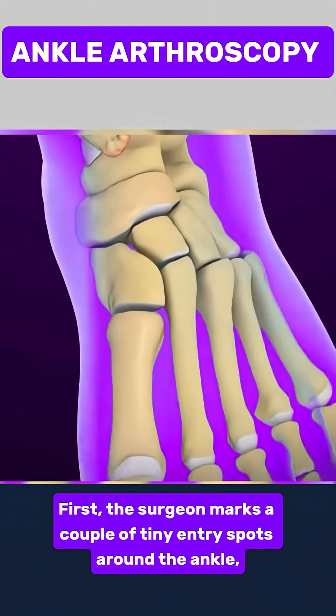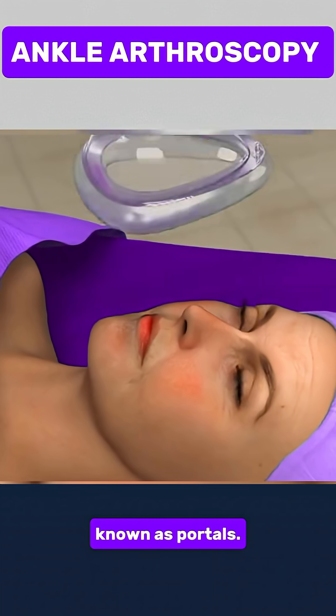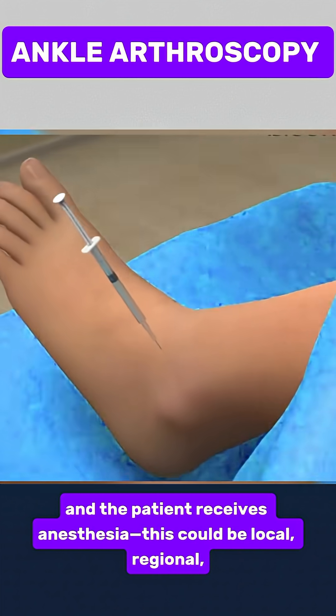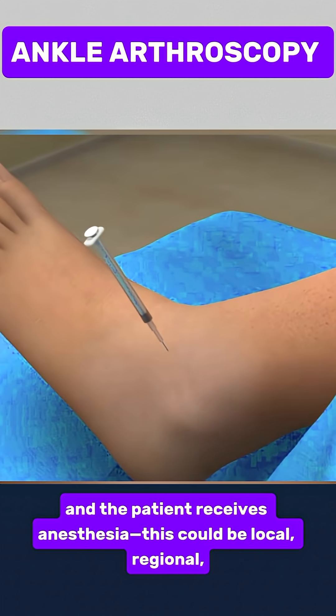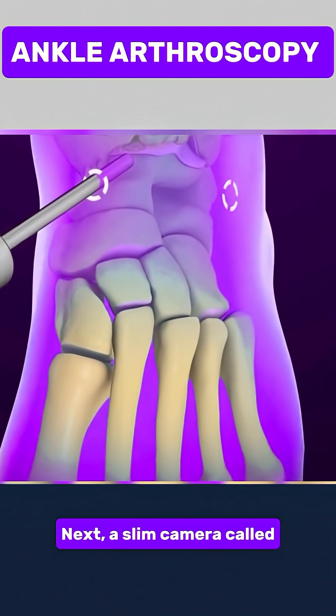First, the surgeon marks a couple of tiny entry spots around the ankle, known as portals. The skin is cleaned thoroughly, and the patient receives anesthesia. This could be local, regional, or sometimes general, so there's no pain during the process.